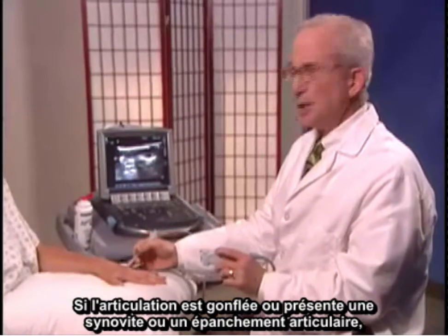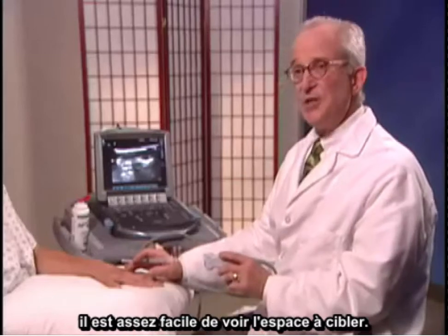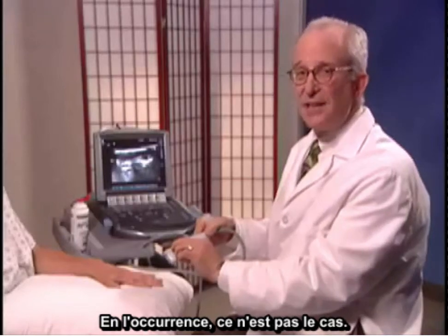If the joint is swollen and has synovitis or a joint effusion, it's quite easy to see the space that you're aiming for. This particular exam, we don't have that finding.